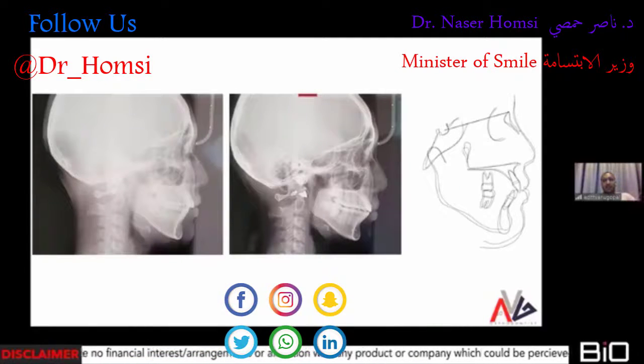As you can see, I've flared the lower incisors quite a bit. The uppers have not flared because I had some good control in terms of elastics and those things. But the lowers, I couldn't control them. They extruded and then they moved forward. So what I'm trying to say is, I'm going to get to the evidence. Now this is about the treatment objective. So I was able to get a decent treatment outcome out of nothing. So this gave me the confidence.